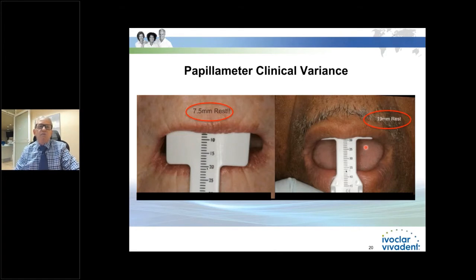I mean, incredible that, all this time, all we have to do is give these measurements to Kelley Dental Lab, and they will make you an occlusal rim totally customized exactly where you want it. And then at this appointment, you would just put it in the mouth and go through phonetics. You'd want to say father, 55, 56, 57.